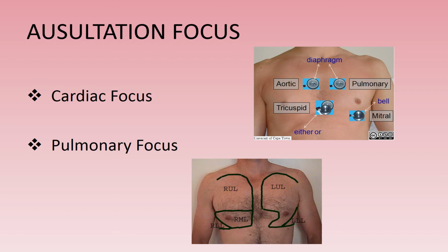This application has another section named Auscultation Focus. It has two parts, cardiac and pulmonary focus. This part of the app has drawings for proper placement of the stethoscope to hear the various sounds.